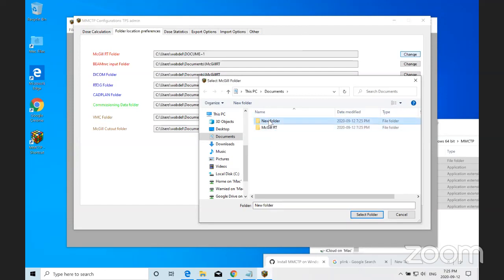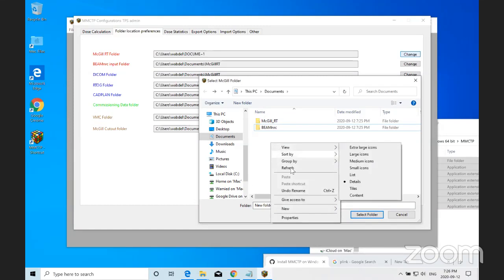What I would recommend, Wameed, and all users, is to avoid spaces as much as possible in folder names. Most of the time, I'd say it's handled appropriately, but we do use some Linux commands with PuTTY and plink, and every now and then it could cause an issue.